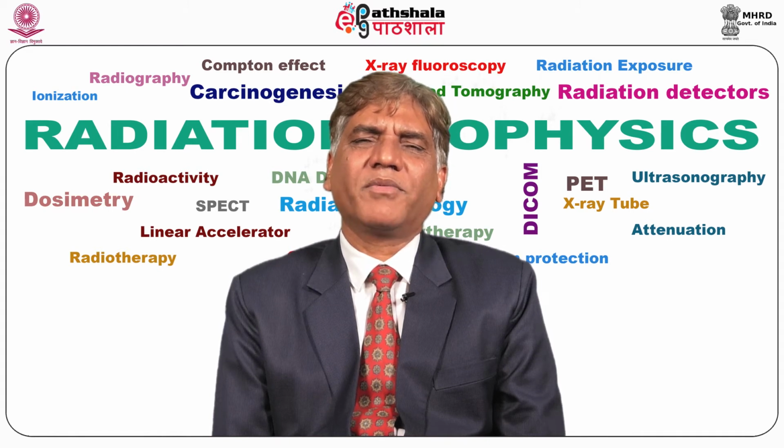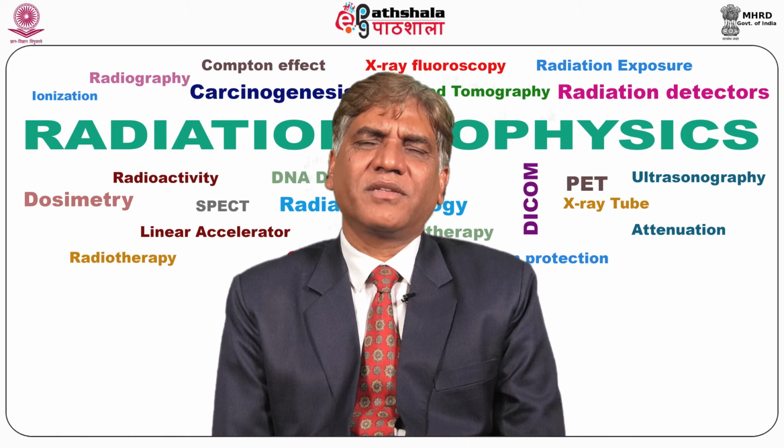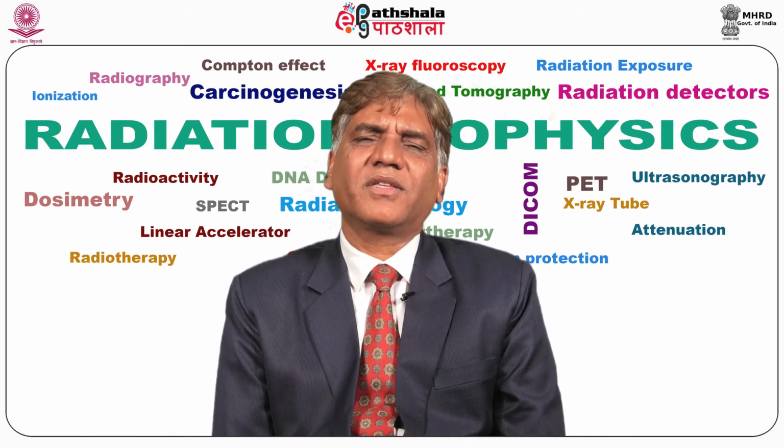So we have seen that CR, computed radiography, is very widely used nowadays. It has completely replaced conventional film screen darkroom radiography.